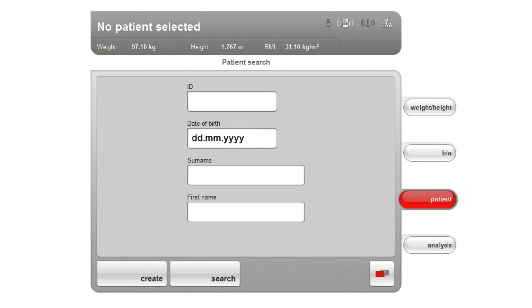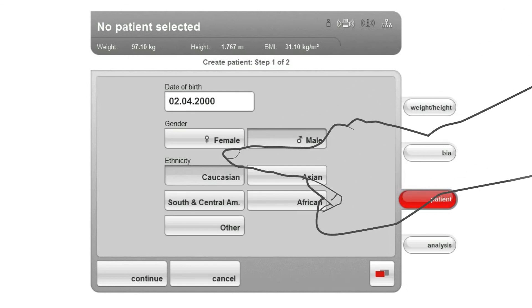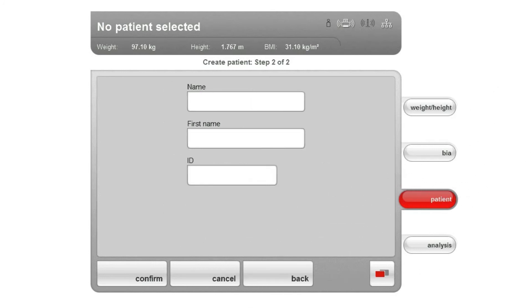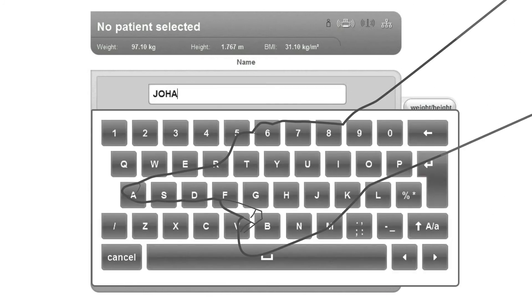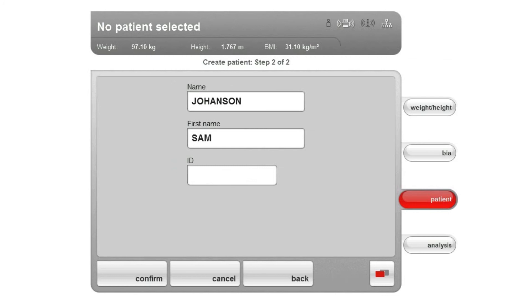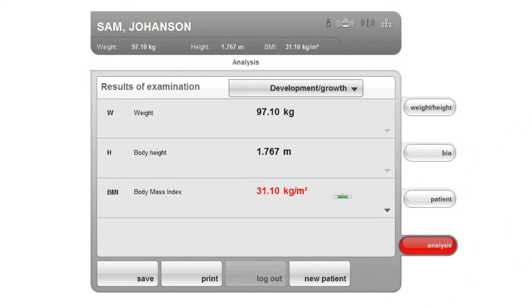If you want to create a new record, make sure that the patient tab is selected. The input form for the patient search appears — tap the Create button. The first input form for mandatory data of the test subject appears. Enter the date of birth, gender, and ethnicity. This information is relevant for accurate formula calculation and output of the individual normal ranges, among other items. Tap Continue. The second input mask for optional entries appears. Enter the patient's last name, first name, and ID. You only need to enter an ID if it must follow a certain format in your system; if you leave the ID field empty, an ID is automatically assigned when the data is saved. Tap Confirm. A summary of the data is displayed — tap Confirm again and the patient's data is stored.